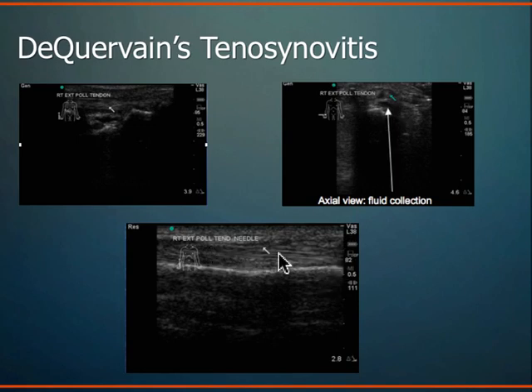And then this is an ideal depiction, but basically you're imaging the tendon. You can see the tendon sheath, and then you can see your needle slip into that tendon sheath and see infiltration of the fluid around the tendon itself. Also nice to ensure that you're not actually in the tendon. Intratendinous injections are contraindicated, especially if you're talking about cortisone. With certain modalities you're actually trying to target the tendon itself, but in general, you're trying to get that medicine around the tendon, but not actually in the tendon. And you can see that quite nicely when you're using ultrasound guidance. It can be quite helpful.